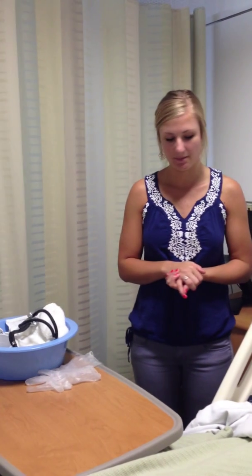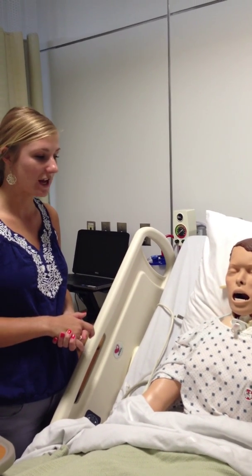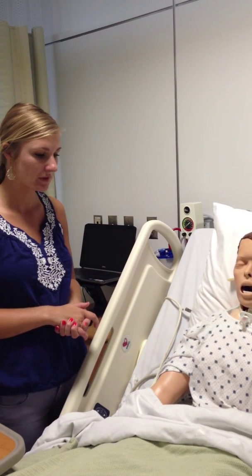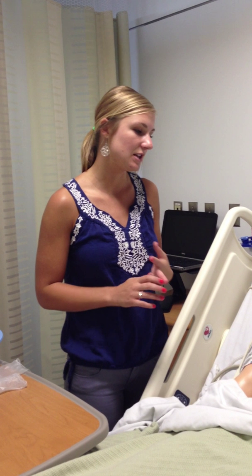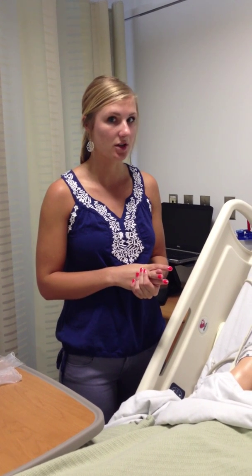I'm going to introduce myself to my patient and say: Hi, I'm Sarah, I'm going to be your nurse for the day, and I'm going to be inserting your NG tube — do you have any questions about that? It'll take about five to ten minutes. I just explained that it's a tube that goes in through your nose and down into your stomach so that we can pass feedings or medications. It's a little bit uncomfortable, but it shouldn't be painful, and you can stop the procedure at any time if you're uncomfortable.